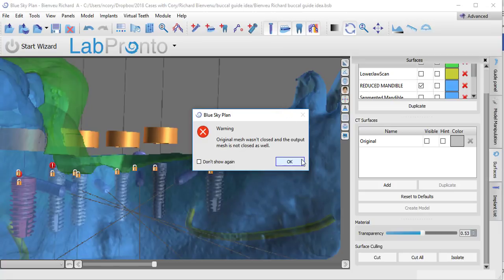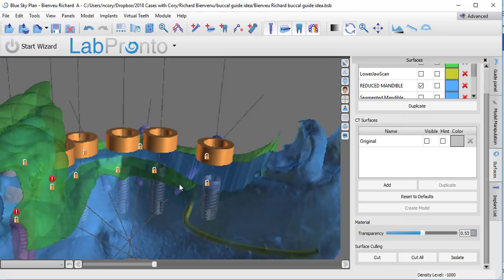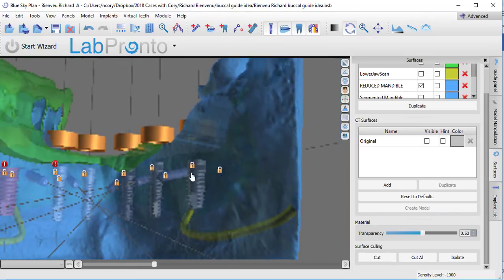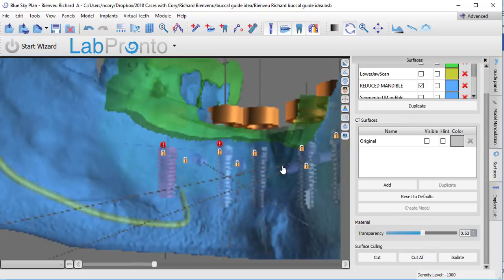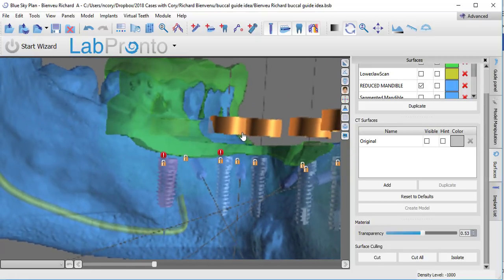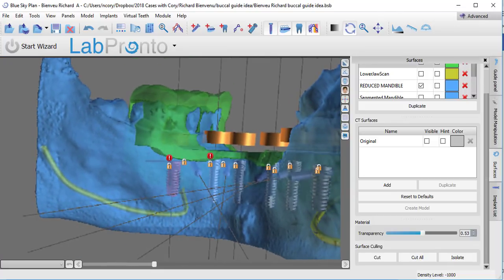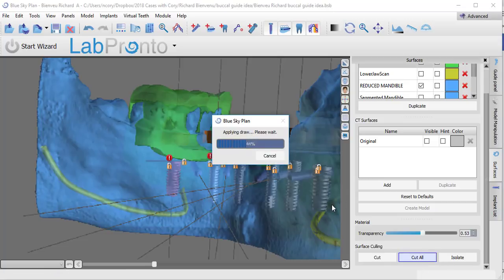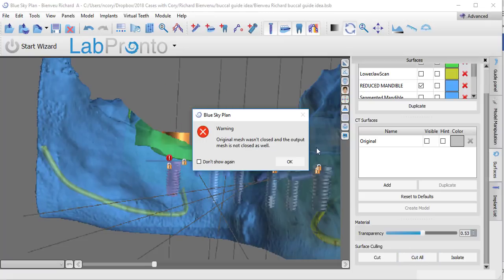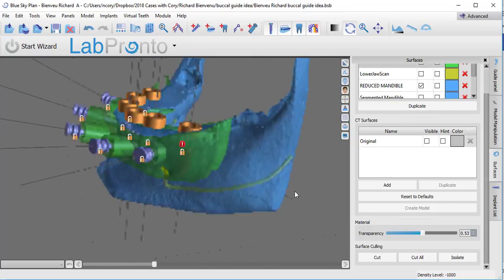Once again, you'll see you have these mesh cut failures. That's all right. One other thing to point out is that you are going to miss some of this lingual portion of the guide. That's all right as well. We're going to come back and take care of that later on. So now we just need to do the other side. Once again, I'm going to flatten this cut where I'm looking straight through it. I need to zoom out enough where I can see all of this. And now we'll make our final bone cut. So hit cut all. And that completes the fabrication of the buccal guide.